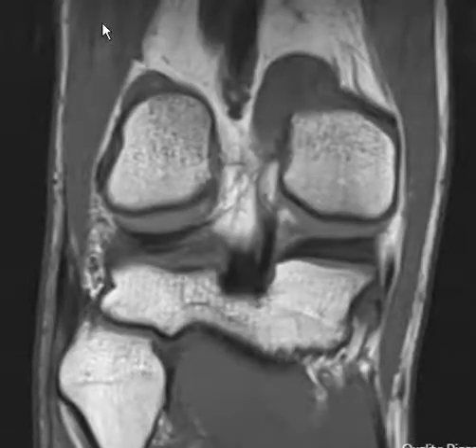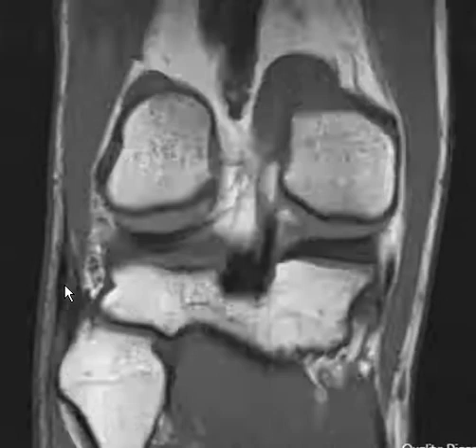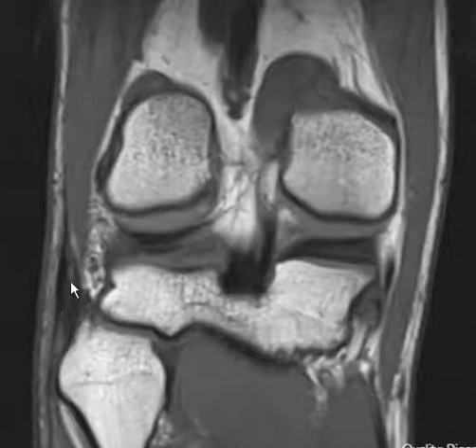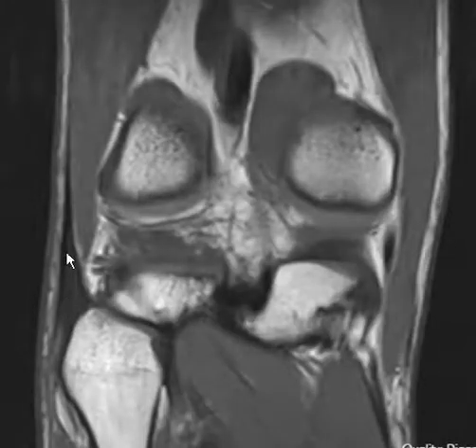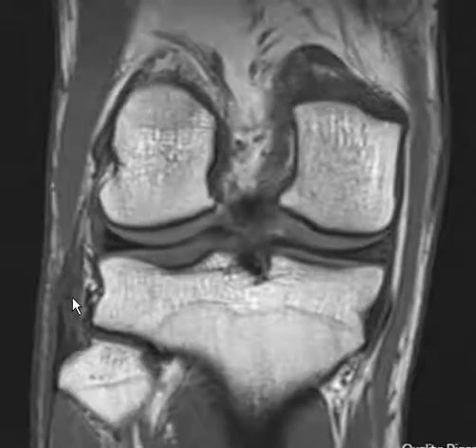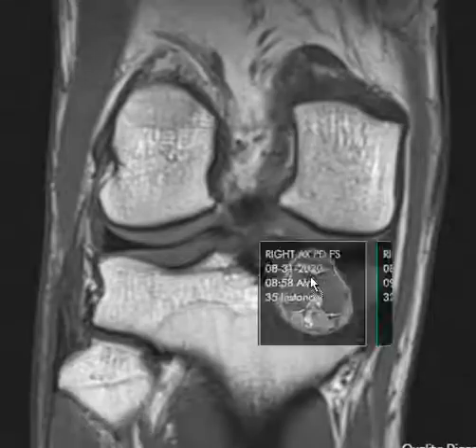This is the biceps muscle — it comes down here and has a really low musculotendinous junction, where the muscle ends and becomes a tendon. It blends in with the fibular collateral ligament to become a conjoined tendon. The posterior fibers coming from the biceps are intact, but the anterior fibers of the conjoined tendon from the fibular collateral ligament are thickened.